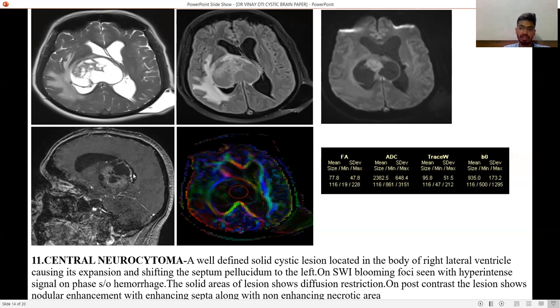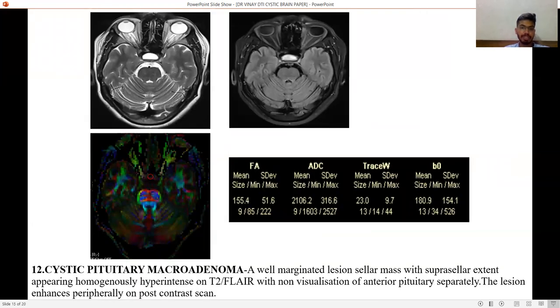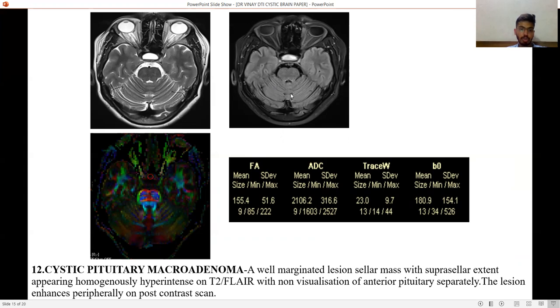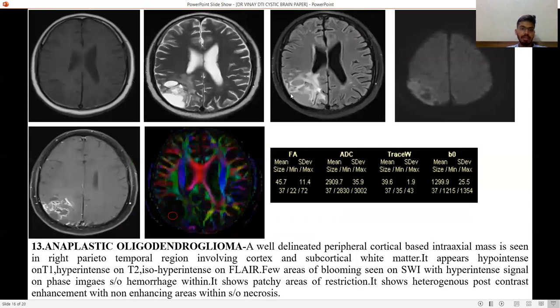Next is cystic pituitary macroadenoma — a well-marginated sellar mass with suprasellar extent. It is a well-margined lesion seen in the sella, appearing homogeneously hyperintense on T2 FLAIR, with no visualization of the anterior pituitary separately. The lesion enhances peripherally on post-contrast.